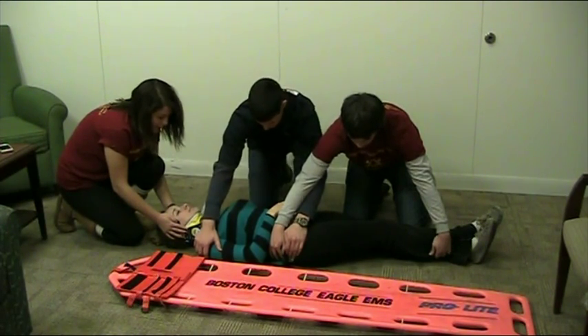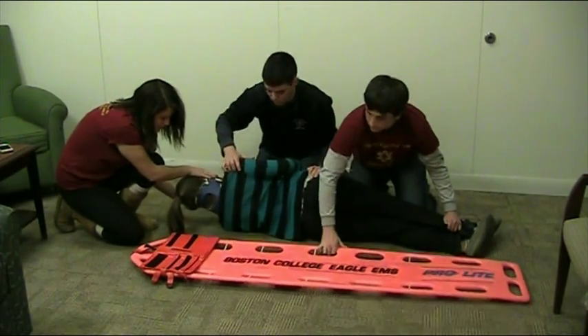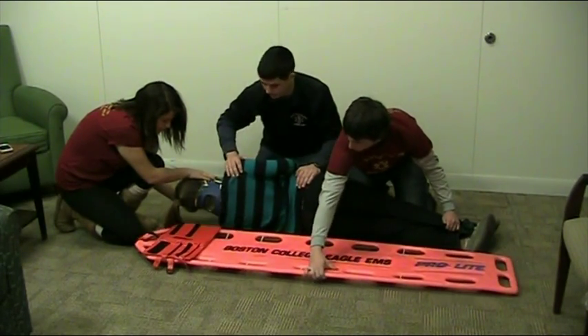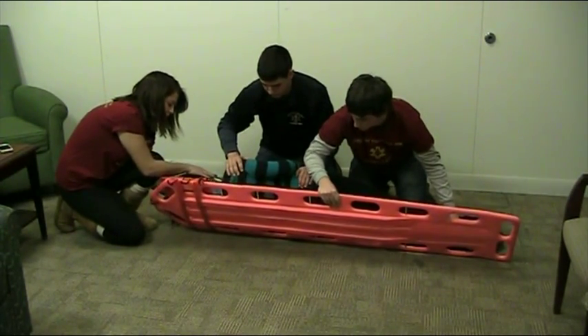Ready? One, two, three. We are moving Kayla as a unit, not to grossly move the spine. I will now check the spine. There are no visible deformities. Ready? One, two, three.